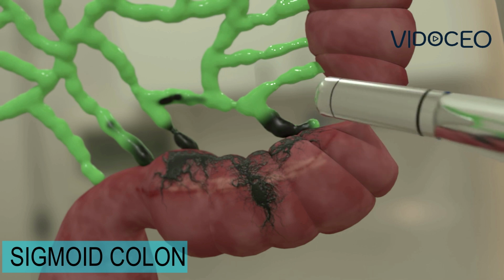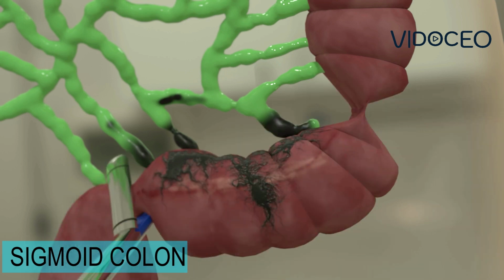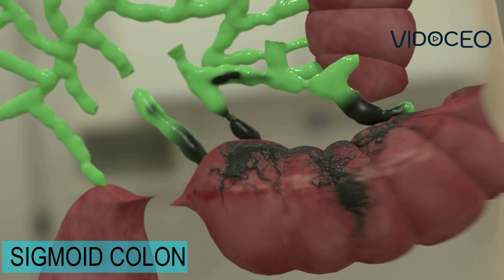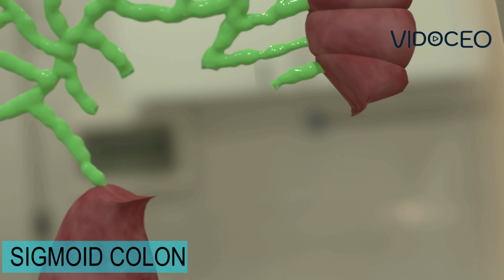Then the colon or rectum below the cancer is divided with a stapler. Blood vessels going to the colon are divided with surgical tools. The area of the colon, with the cancer and the attached lymph nodes, is removed.